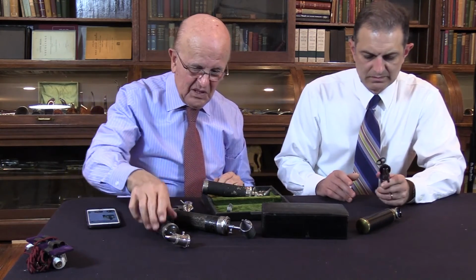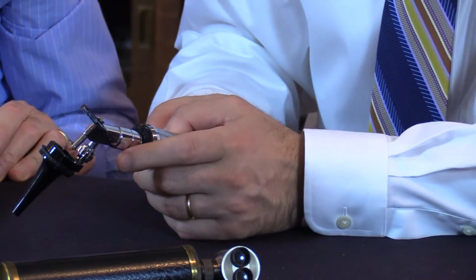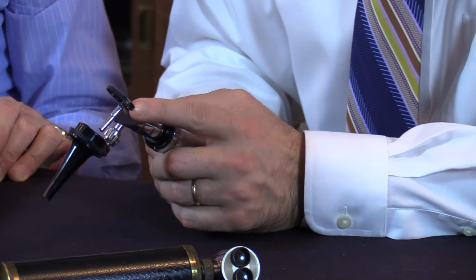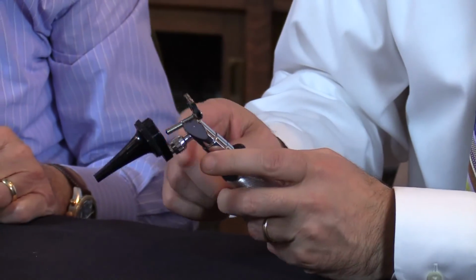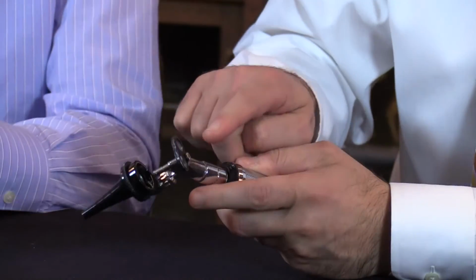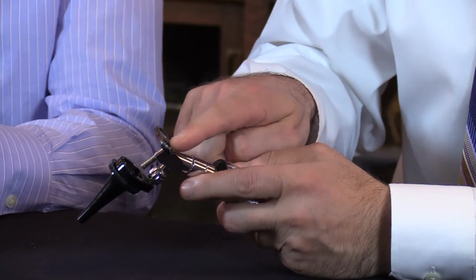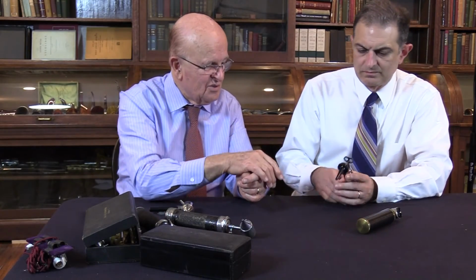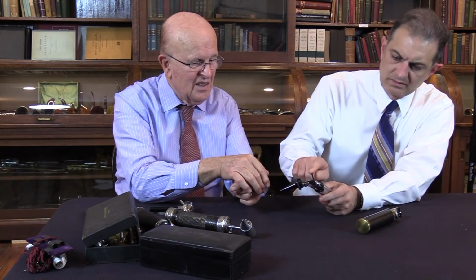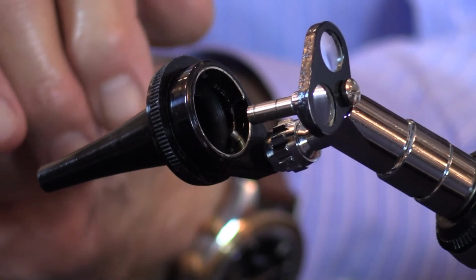These scopes are very unique, and probably even today would be of some benefit. So this is a scope essentially with an operating or procedure head, but instead of just having a single small lens, it has dual lenses, and they're just different focal lengths. So you can see a little deeper with one than the other, and focus a little deeper in the canal on the tympanic membrane.